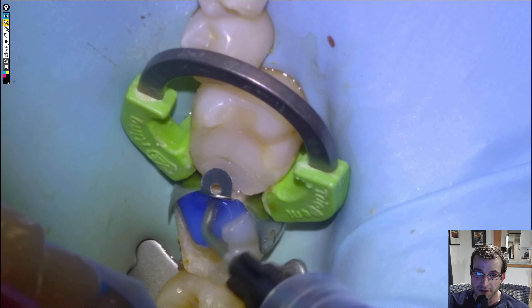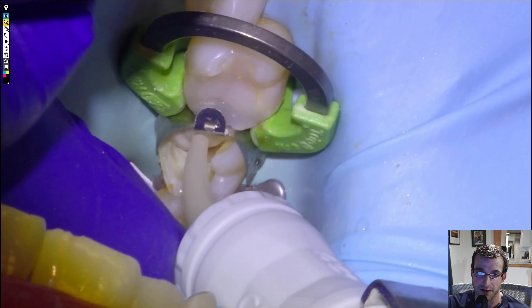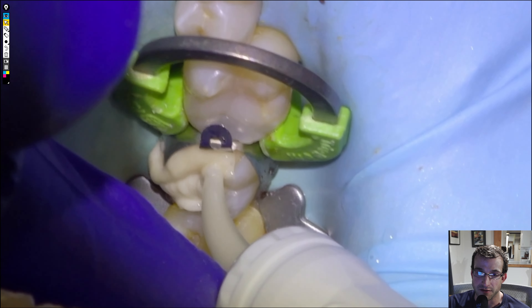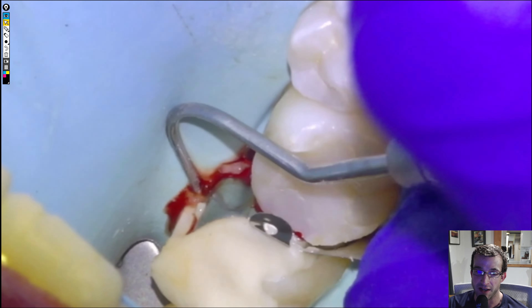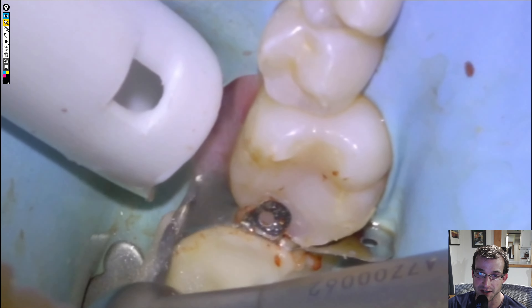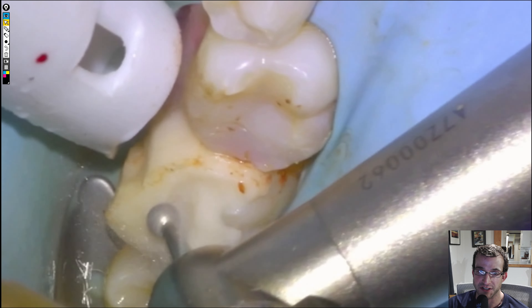So we're ready to restore. I like to do the five-second phosphoric acid etch to condition for Equia Forte, and then we'll put in two capsules so that we don't end up with voids, and then we'll pack it in a little bit with the cotton pellet and wait five minutes for it to set. Remove the matrix assembly — we had a little bit of material go out that little hole in the matrix, so we just had to cut it off, and then remove the band with the Howe pliers, and then we'll start shaping the filling.